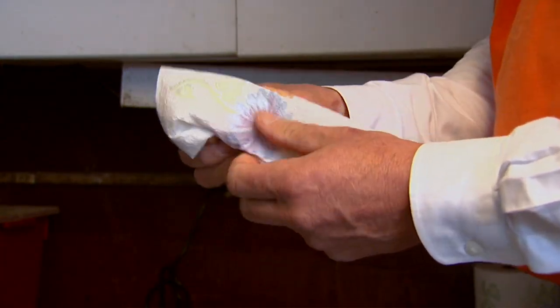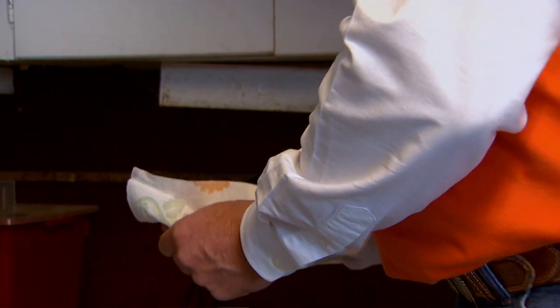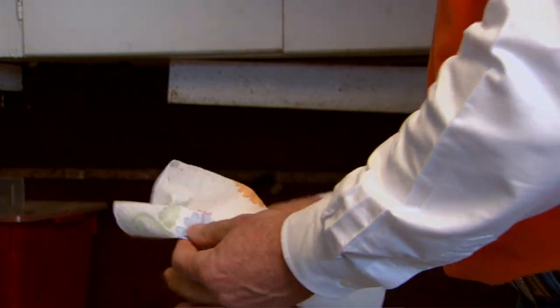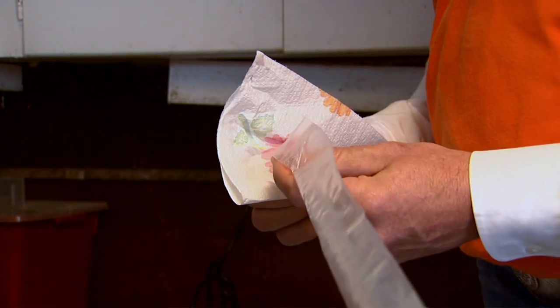Water is very toxic to the sperm cell, so it needs to be completely dry when it comes out. We can either use what's called a straw cutter or a pair of scissors — that just opens the top up.